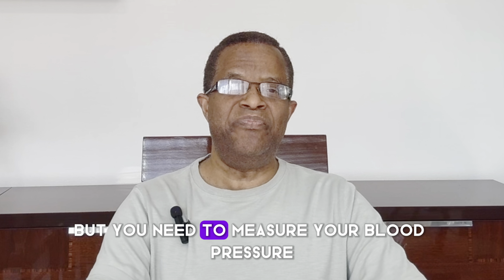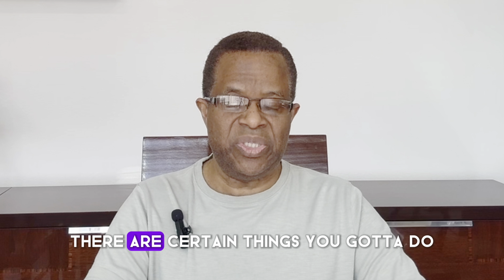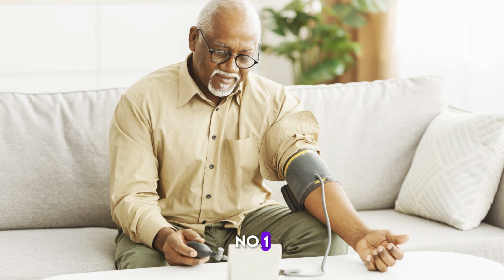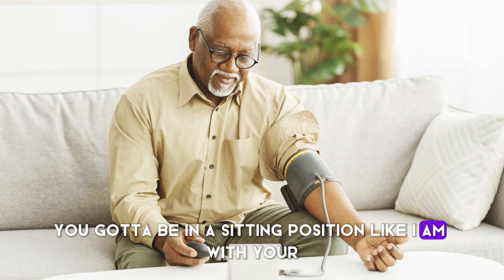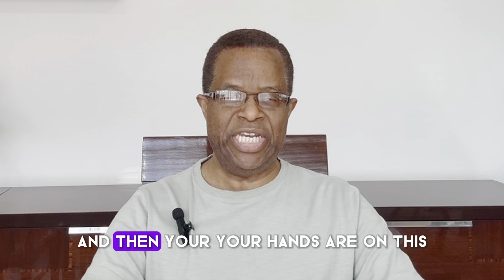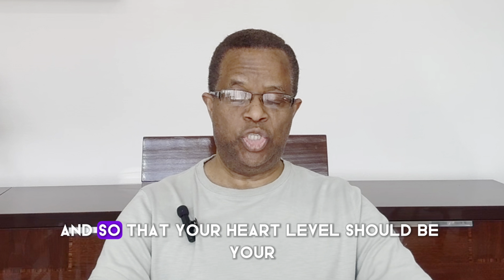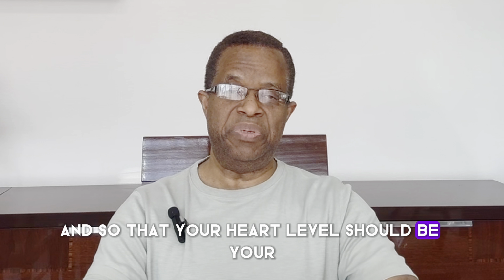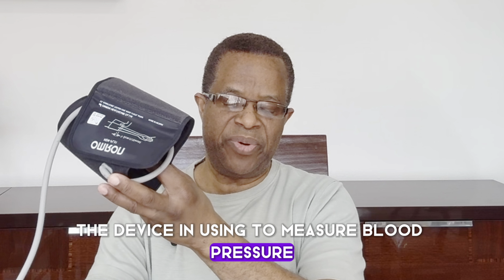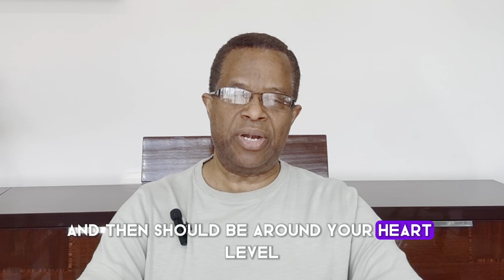But you need to measure your blood pressure in a very quiet environment. There are certain things you've got to do when you're measuring your blood pressure. Number one, you've got to be in a sitting position, like I am, with your back straight and your hands on the table, so that the cuff, the device used to measure blood pressure, should fit your left arm and be around your heart level.